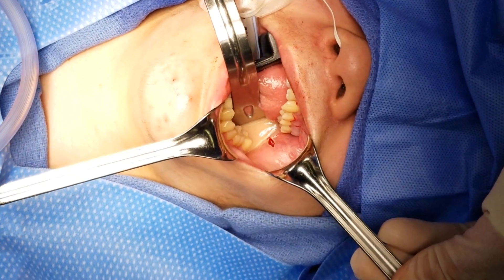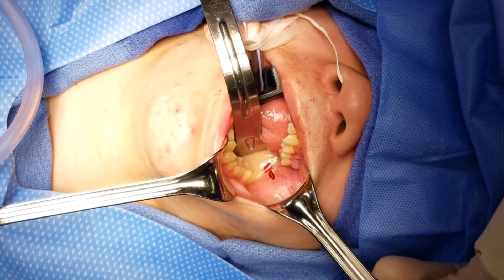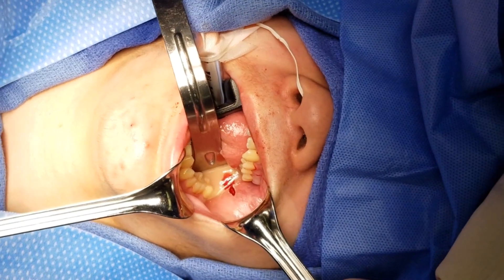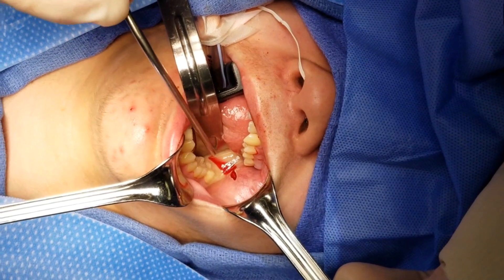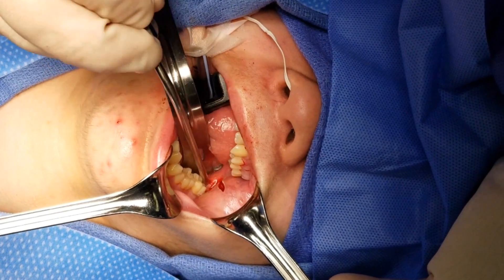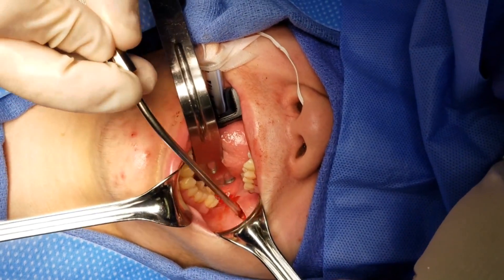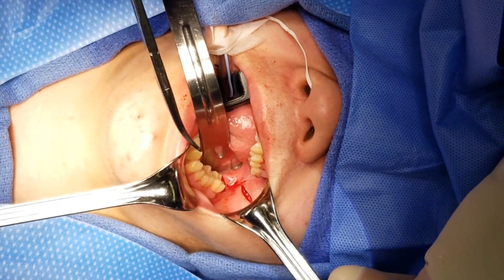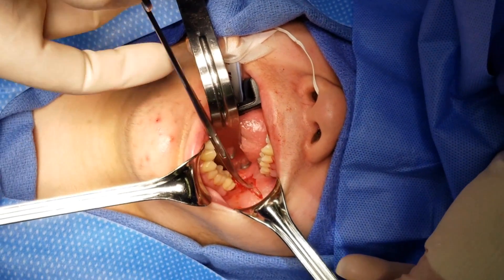One-handed? Yeah, you can do it. Okay, and then we'll just make sure that we got everything broken up. Oh yeah, see?